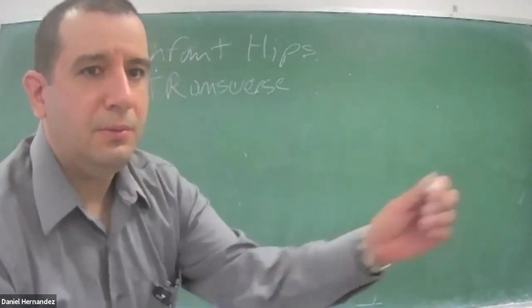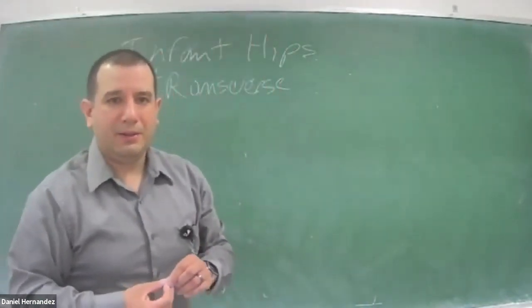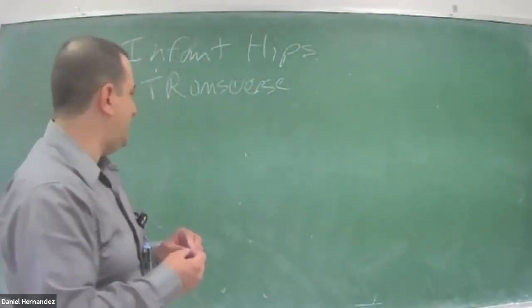This view is commonly referred to as, I've heard it referred to as a champagne glass. Other people have referred to it as kind of like a seagull.